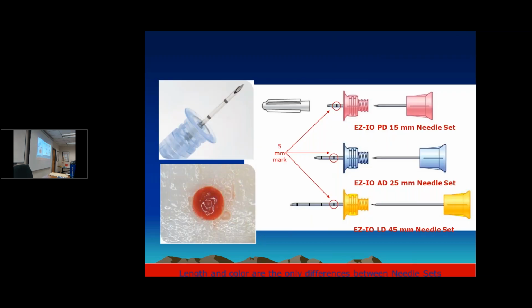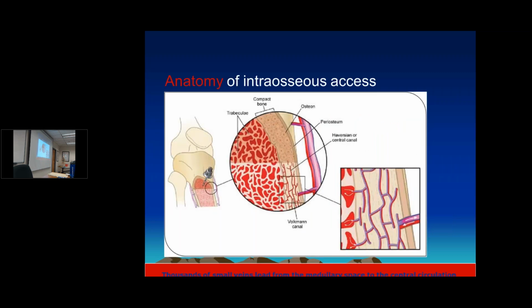And that's just exactly what we just got finished talking about. These are the marks that we're talking about right here. Okay, these marks right here are where it's intended to stop, and the drill itself should draw it down in terms of telling you that you don't need to go any further along the way.